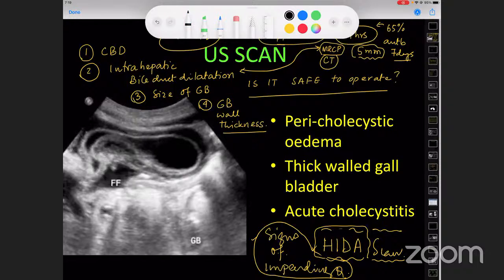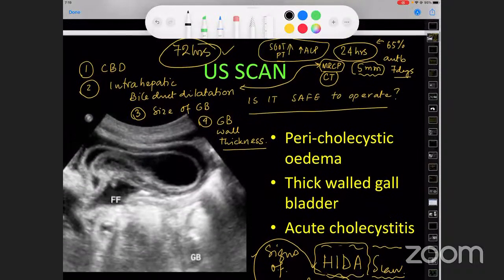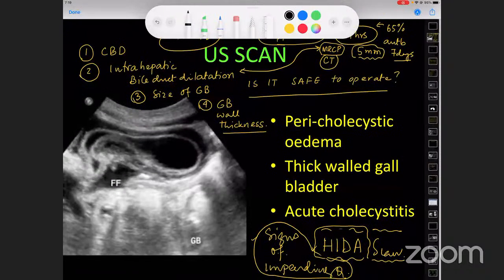Signs to suspect a cholecystoenteric fistula. Exactly, I was going to come to these two, Avik, because cholecystoduodenal and cholecystocolic fistulas are not that rare, because we have a long experience dealing with them, and they are all surprises. So rather than getting surprised, can you have an idea whether there is any cholecystocolic or cholecystoduodenal fistula on ultrasonography? On ultrasonography or any other cross-sectional imaging, we could see the cholecystoenteric fistula very well.